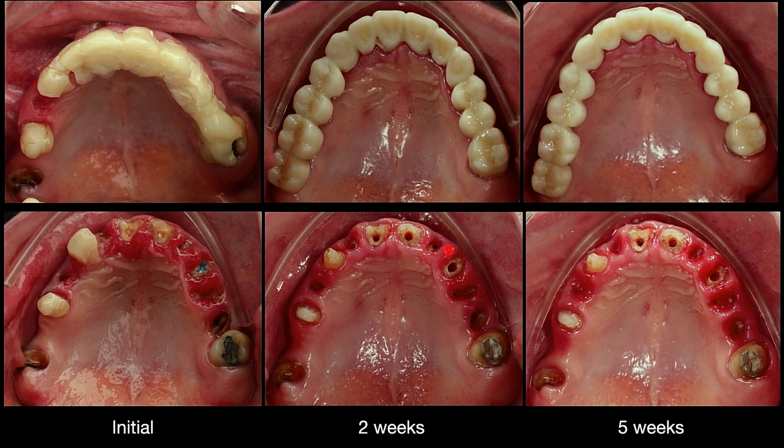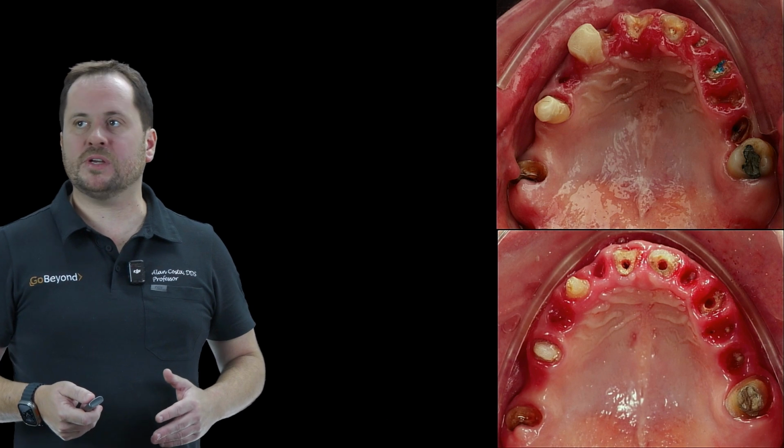Because look at how this adjustment works, folks. It allows for a significant improvement in the tissue. And as you can see here, I already have healthy tissue. And look at the gingival irritation I had in this area. And then things start to progress. You have the provisional set, you can move on to other provisional sets to improve the shape. And you achieve a significant improvement in the patient's gingival condition. Here we started to better condition the tissue in that region. And we were conditioning and working with these temporaries, which resulted in a much better situation.